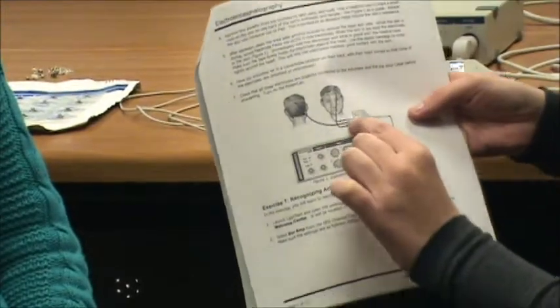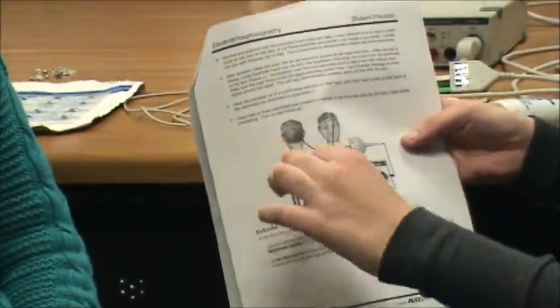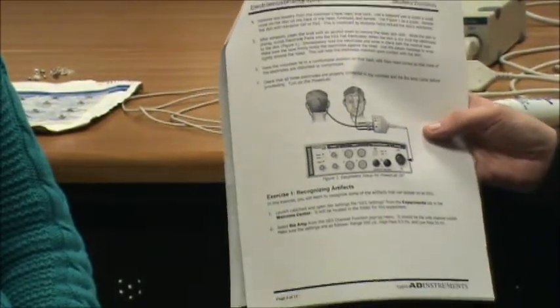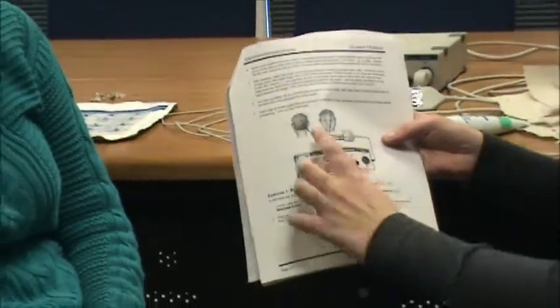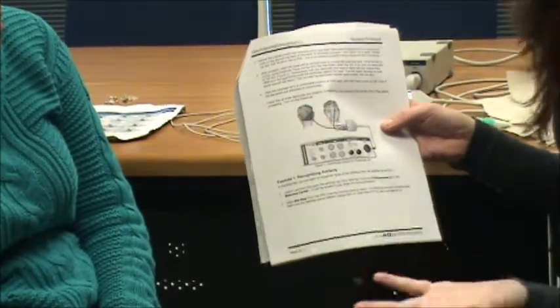Then we'll put the second one, which is a black one, at the back of her head. Your subject will probably have to hold it on to their head to make sure it'll stay, or you could get a band put around it — either one is fine.